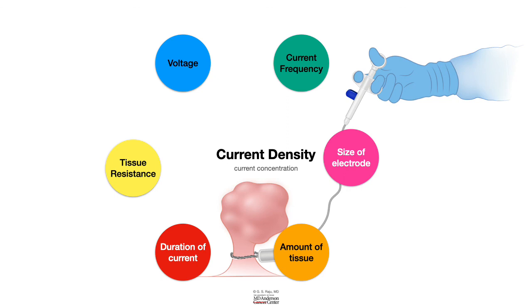So we have learned a lot about electrosurgery, the different types of effects, cut and coagulation, and the different types of current and the voltage and the cycles that determine that. And I hope this is useful. We will learn more about the applications of electrosurgery, how to set up the machine, etc. in the next classes. Thank you.